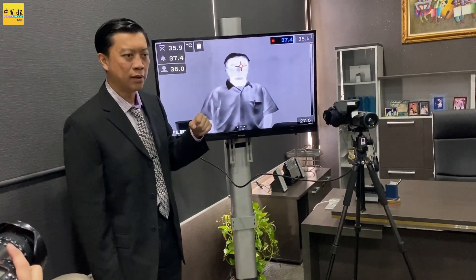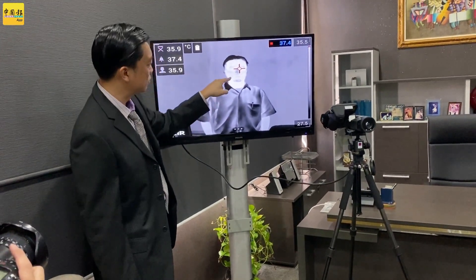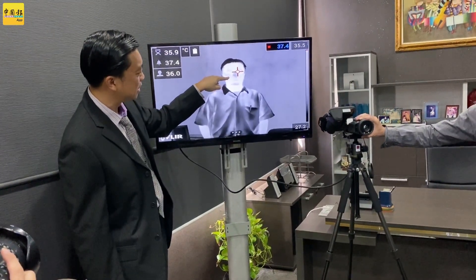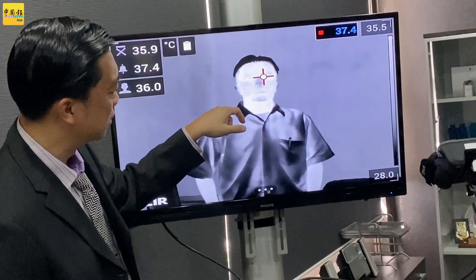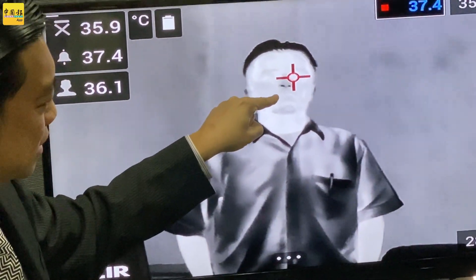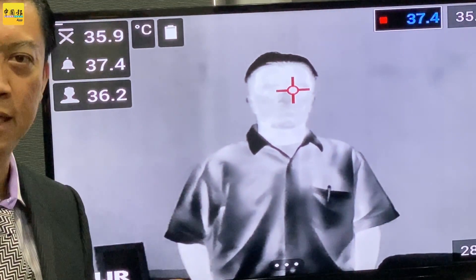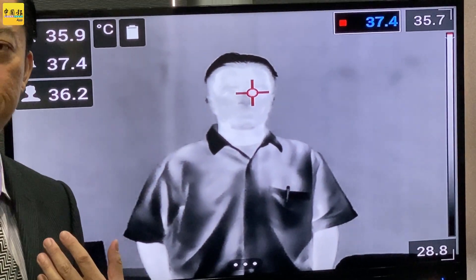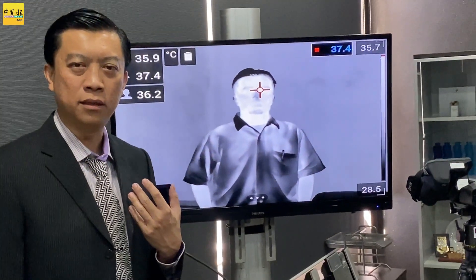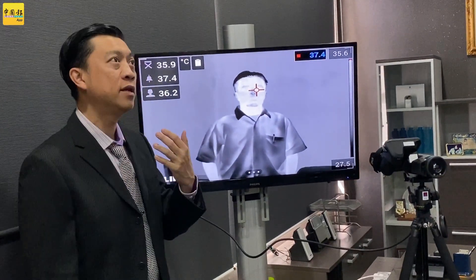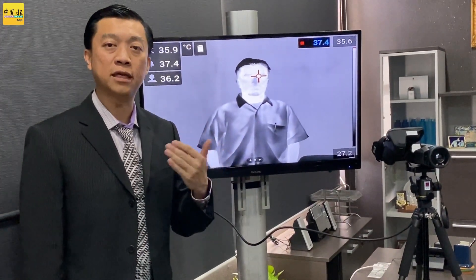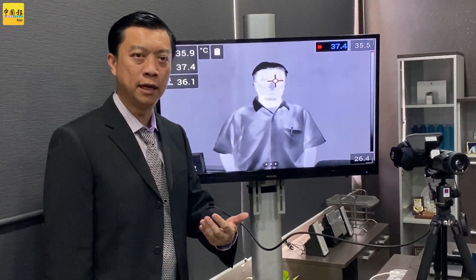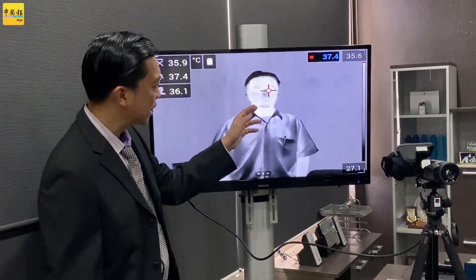How sensitive is this piece of equipment? Just take a look at the nose area — you can see that it changes. The nose area becomes darker and then brighter. The reason for this is that as we breathe in it's cooler, and when we breathe out, because the air is coming from inside the body, it comes out hotter. So you can even see somebody breathing.